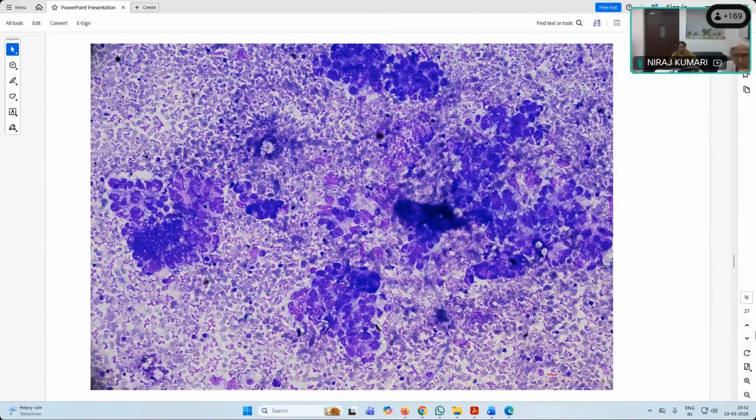A yolk sac tumor you said is a germ cell tumor because I am saying SALL4 is a pan germ cell marker. So any germ cell tumor will be positive for it. I want to specify that this is yolk sac. Yeah. AFP. AFP IHC. Anything else? Yes, ma'am.